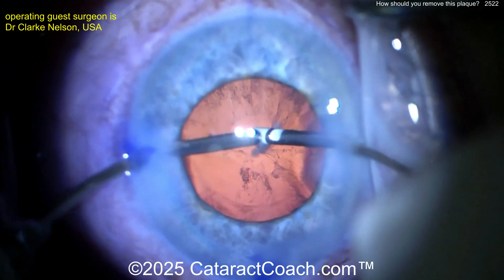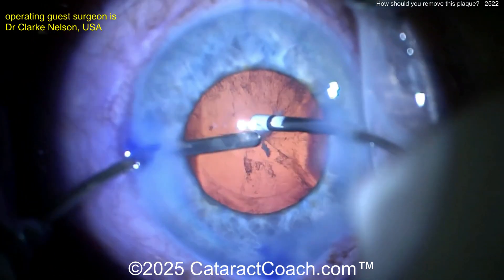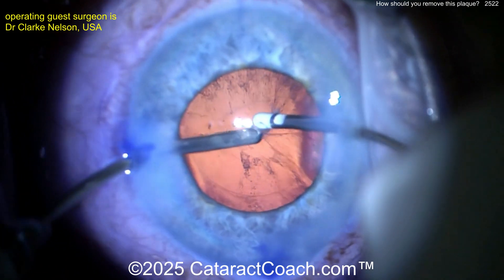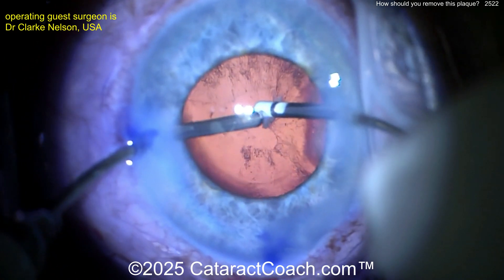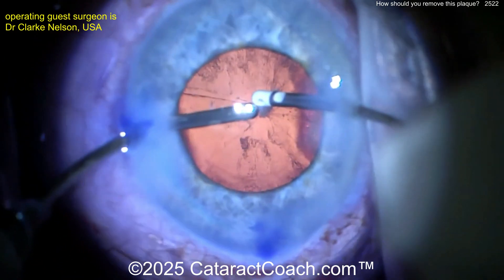So the surgeon's trying to get that piece pushed in here into the aspirator tip of the bimanual IA setup — kind of going, but kind of not really. And if you keep meddling with it, what's going to happen is it's going to pop. So what are you going to do? Let's take a look. It's kind of going, kind of not.